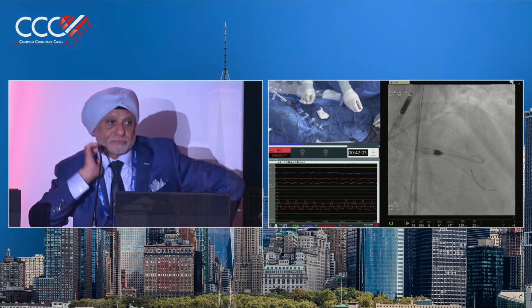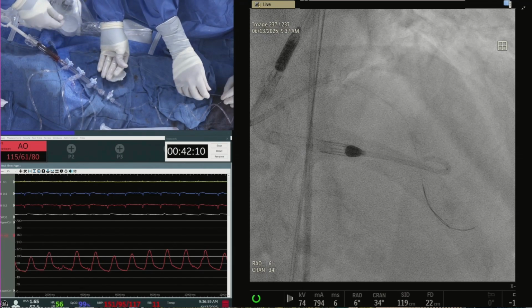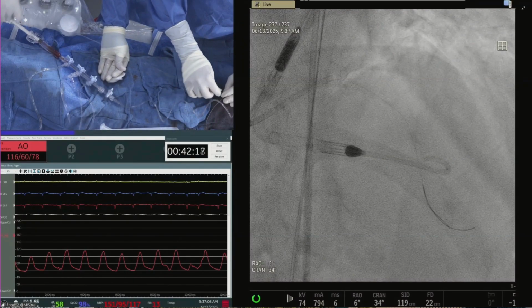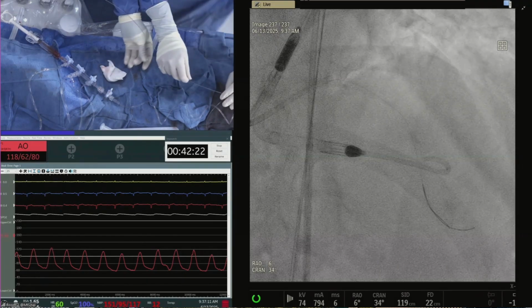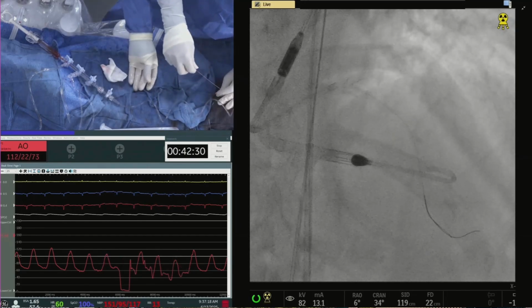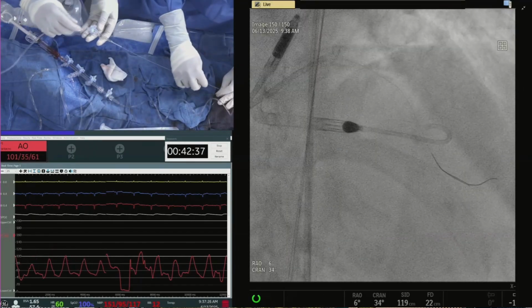So that's great. Instead of dilating, would another option be a larger burr at the origin of the LAD, which would be less likely to close the LAD? Yeah, not a bad idea. Larger burr right there, even a 1.75, just to the origin of the LAD. Ideally 1.75, but maybe we have to do 1.5, but we're already going with the balloon. That's an excellent idea, number one. Number two, somebody may tell us to image and do IVL, but IVL can give rise to dissection.